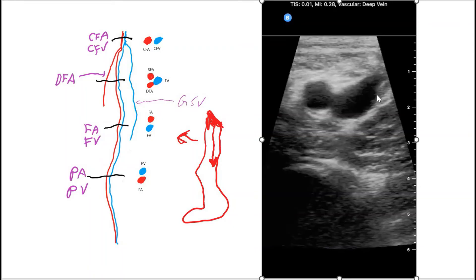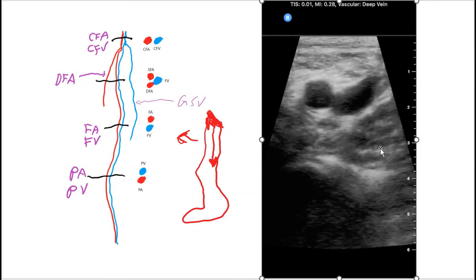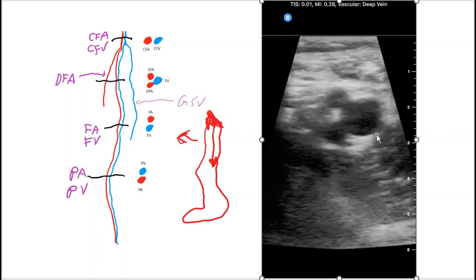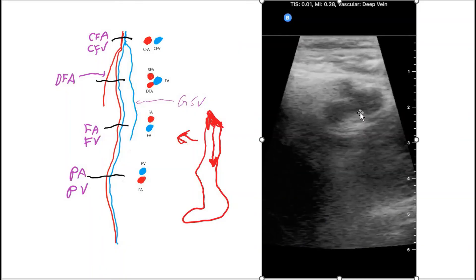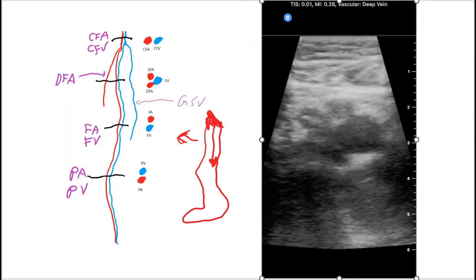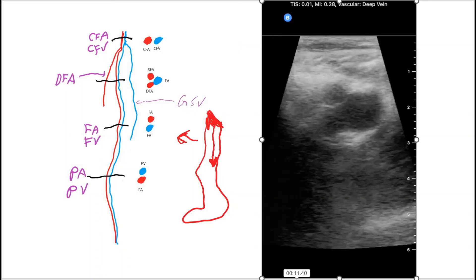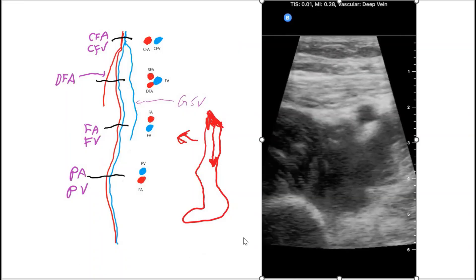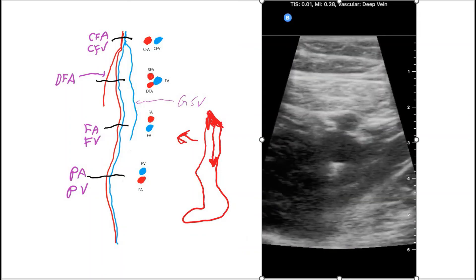Backing up, I just want to point out that the vein is on the right side, the artery is on the left side of the screen. Here we have the indicator on the left side of the screen. Remember the indicator on the probe is pointed towards the right side of the patient. So here as you are scanning down the vein stays on the right side. And like I mentioned before this is the Mickey Mouse sign. The artery's on the left side, the vein that's on the right side that was compressed. And this continues to go down right above the knee area.